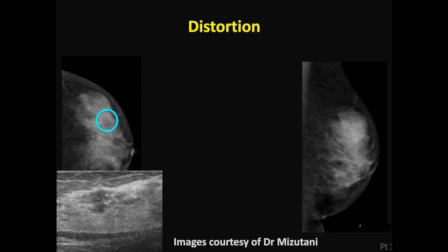And if you look at the literature, we've recently published a study demonstrating that it really doesn't matter when we do patients in their cycles for MRI, because the sensitivity for cancer detection is no different regardless of where the patient is in her cycle. There have been other papers on that in the past. Dr. DiMartini and colleagues had also demonstrated this. So we do patients as they come. It is way too complicated to try to do things based on cycle, and we have no scientific evidence to demonstrate that it makes a difference.